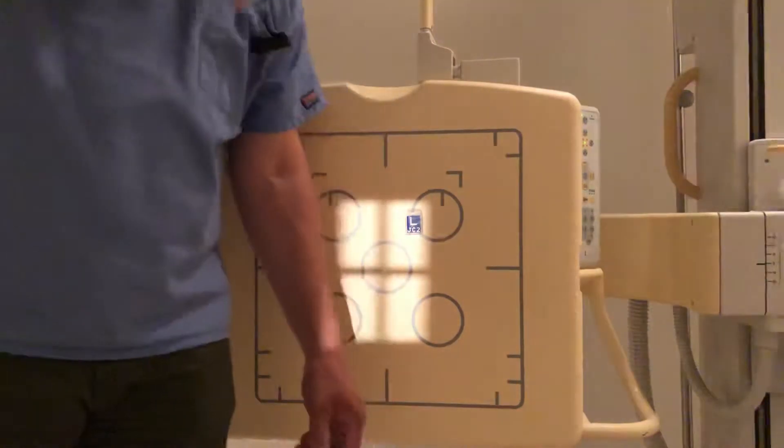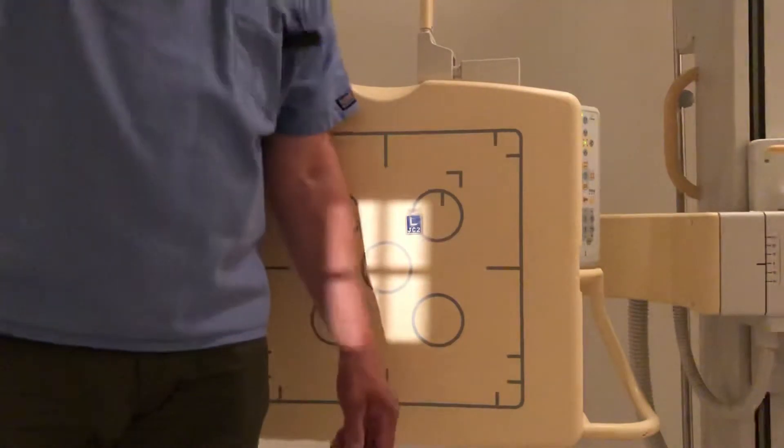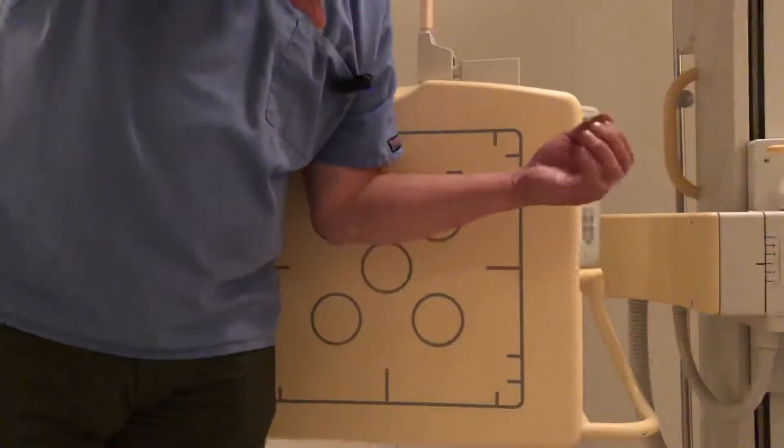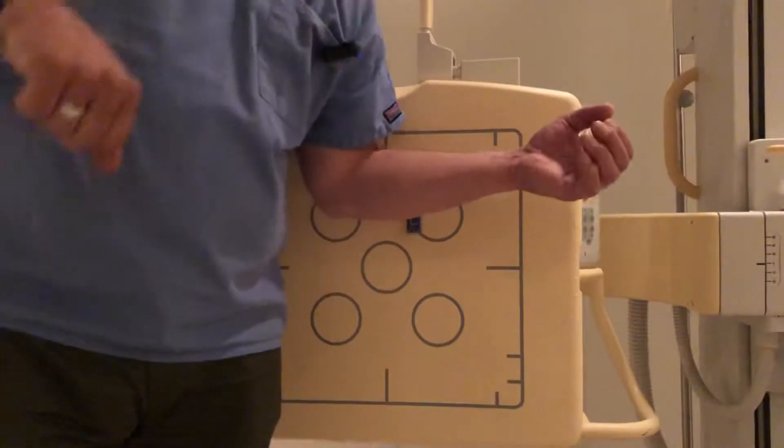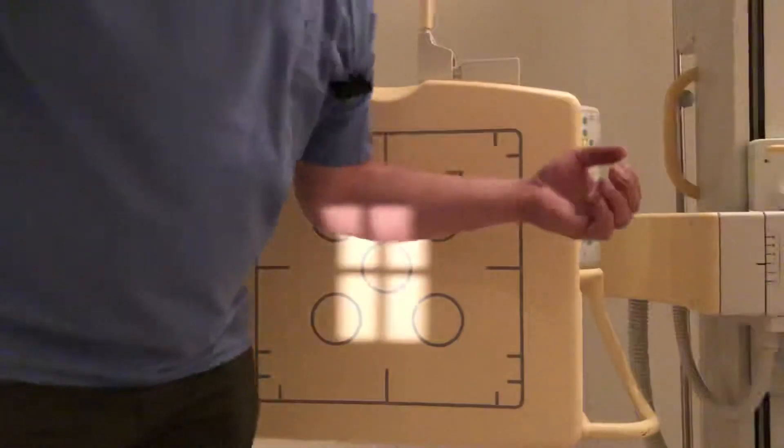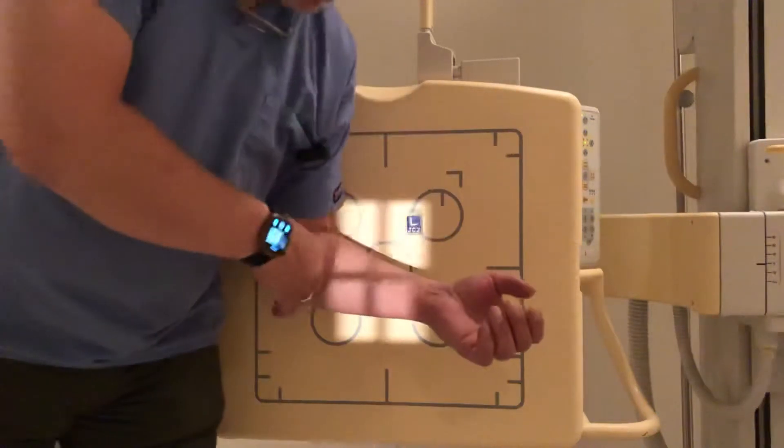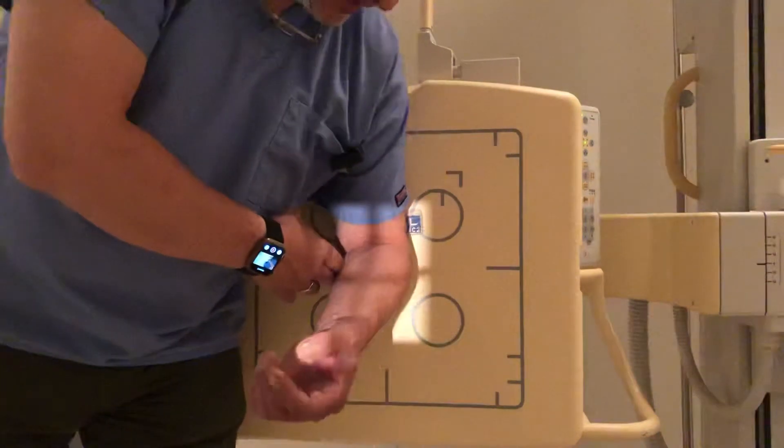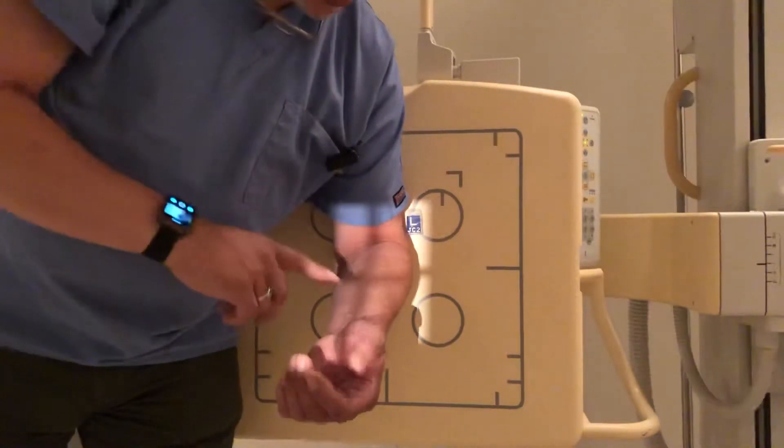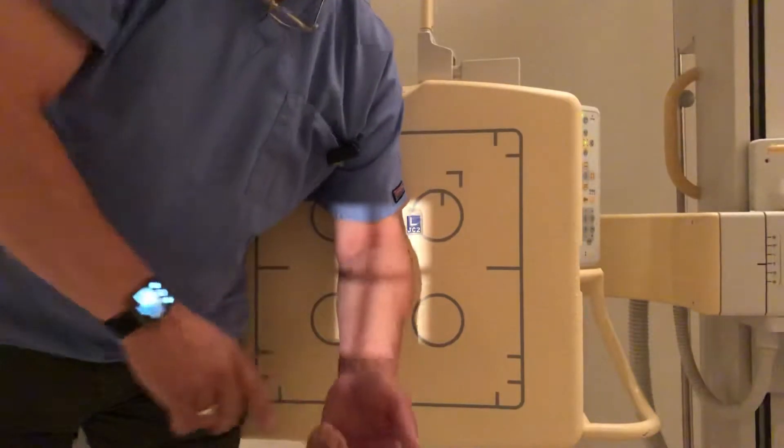Alright, so this is a trauma elbow series done upright when the arm is flexed about 90 degrees. So what we're going to do is they'll come in, then we're going to have them turn this way and see the shadow that's going up and down my forearm.